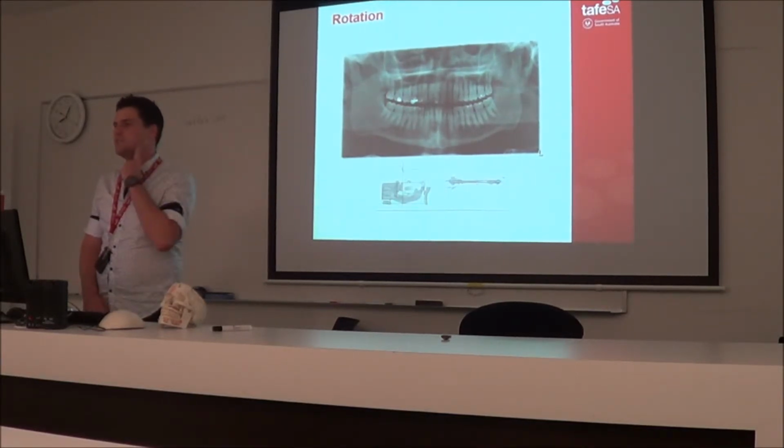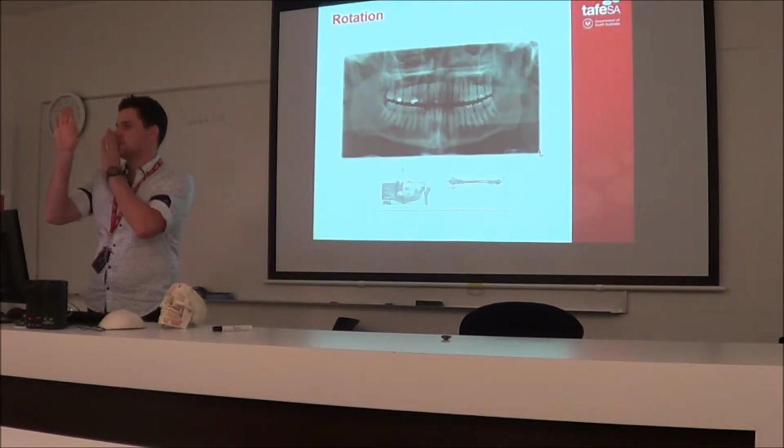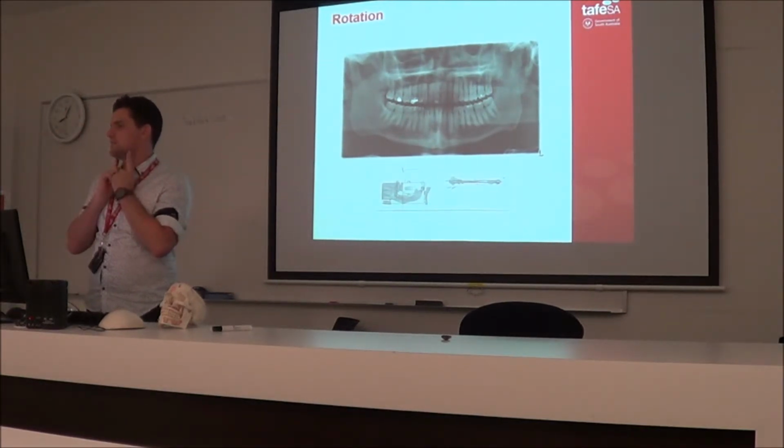So you'd get your physical left, you'd turn it to the sensor. Okay, so then as it's going around, too close to the sensor, right side is too far away. So how would you correct the patient? You'd move them back to there.